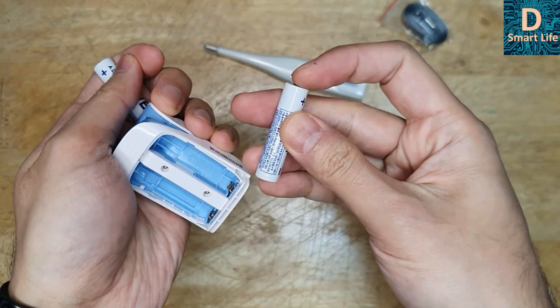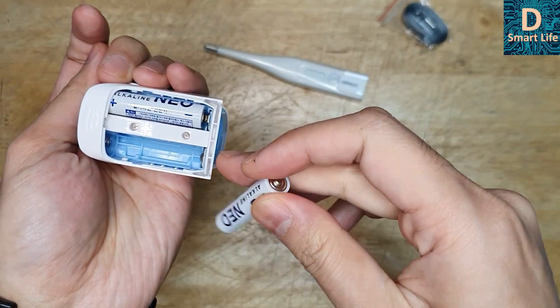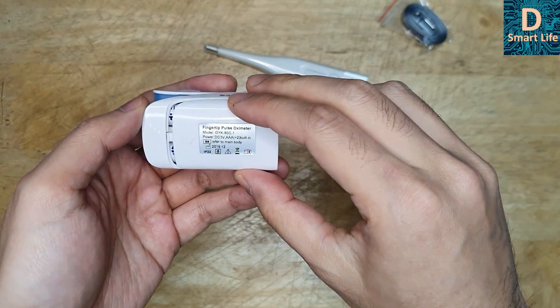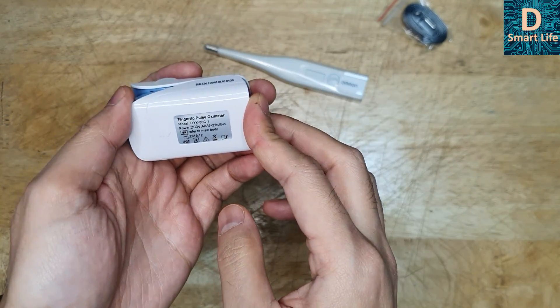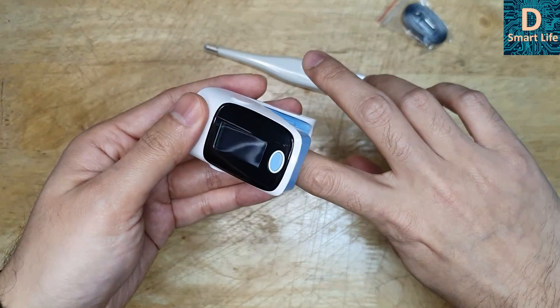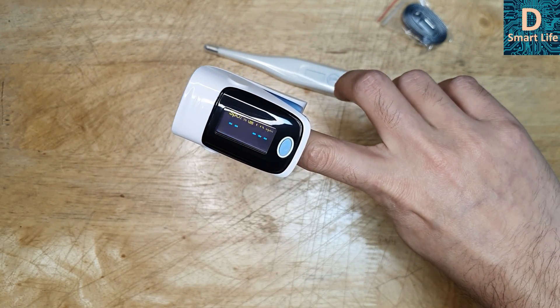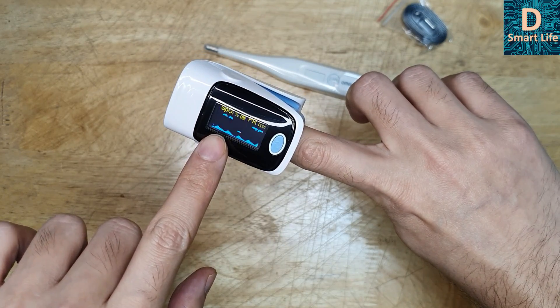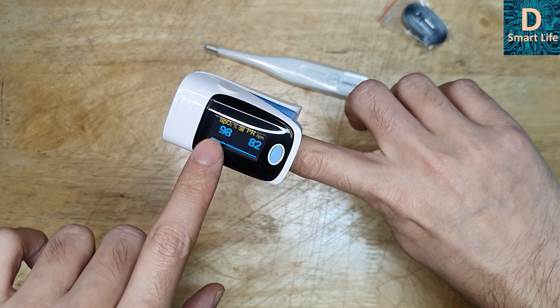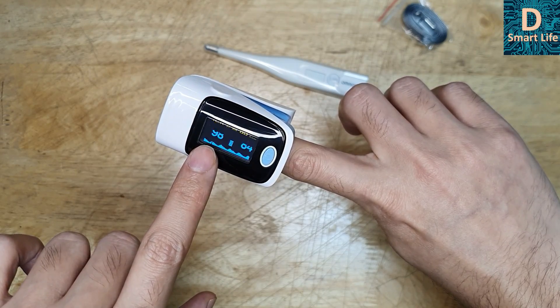So this is plus and minus — be careful. The negative and positive polarity should be correct. I don't know whether it has any reverse polarity protection. Let's plug them in and turn it on. It says 'oximeter' and starts up. This is the oxygen level in my blood — it shows 99%. And this is my pulse, around 80. This is the level we are looking for in the case of coronavirus, COVID-19, or other respiratory diseases like pneumonia.